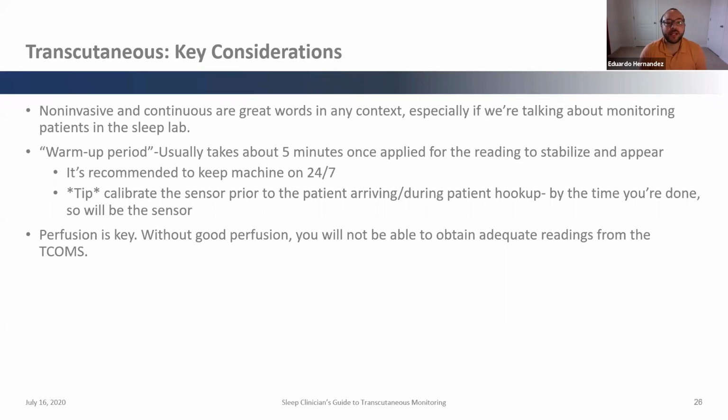So some key considerations here. I had mentioned before, non-invasive and continuous are phenomenal when it comes to the context of a sleep lab. The last thing we want to be doing is waking up the patient and taking arterial blood gases for their CO2 readings in the middle of the night. Hold still, I'm going to stick your arm, this and that, especially for respiratory therapists. So this method of monitoring CO2 non-invasively, so no shots, and continuously is very important.